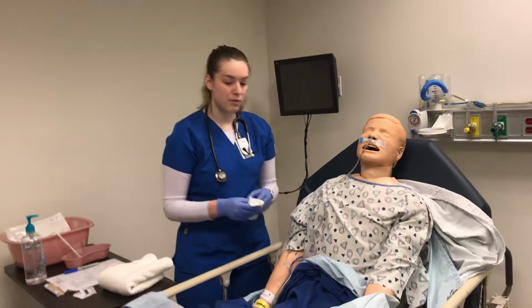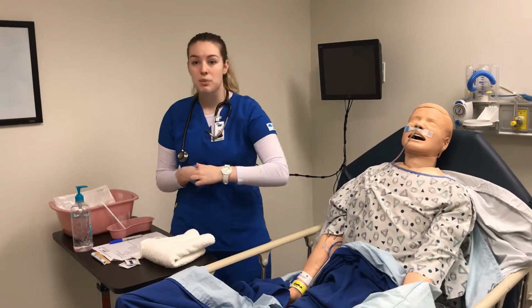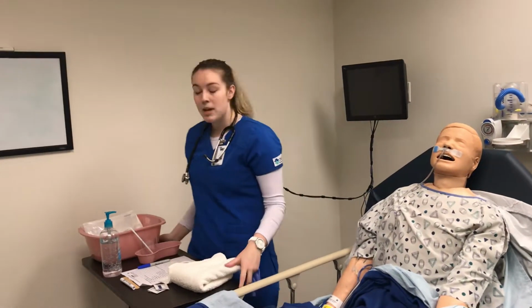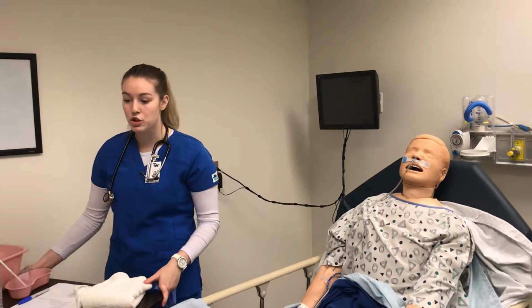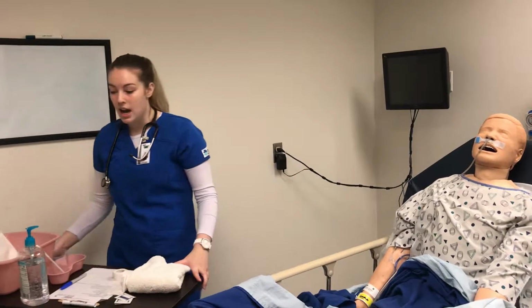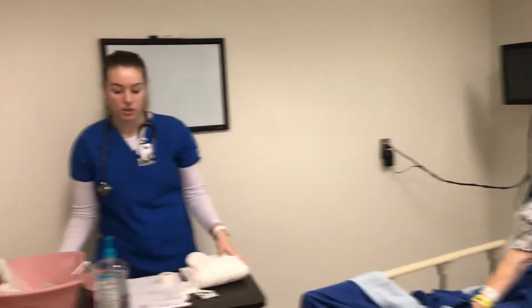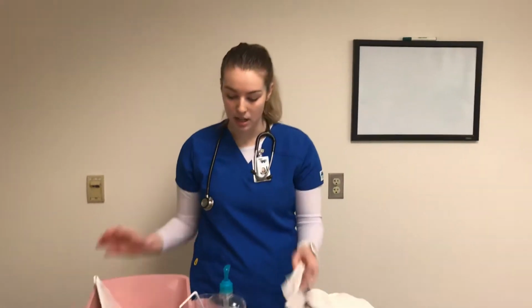Okay, do you need anything before I leave the room? No, you're okay? Okay, so at this point I would tidy up my room and my workspace, make sure my patient is in a comfortable position, which we're just going to leave them in high Fowler's as I am going to demonstrate removing it. I would replace the pillow if they want and they're comfortable with that. After x-ray, I would come back and hook them up to the suction machine, but we have to have the x-ray to make sure that the tube is placed correctly. So now I can move on.